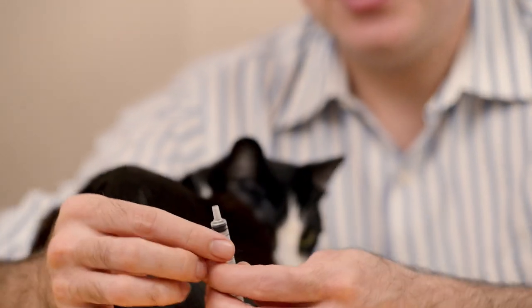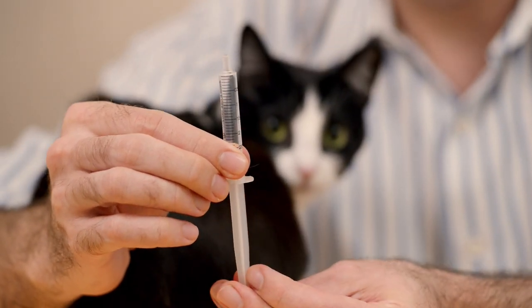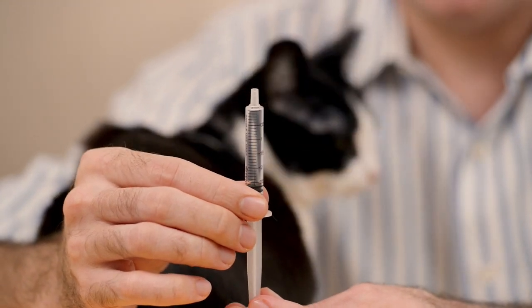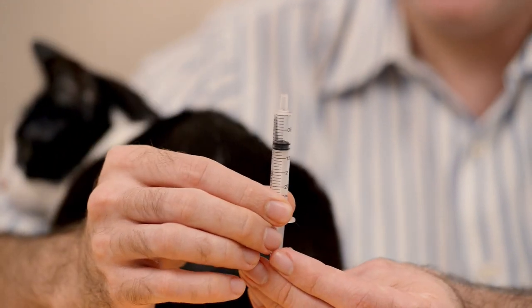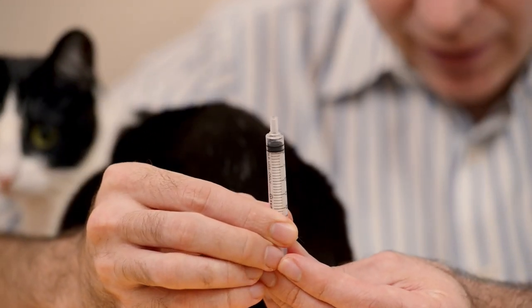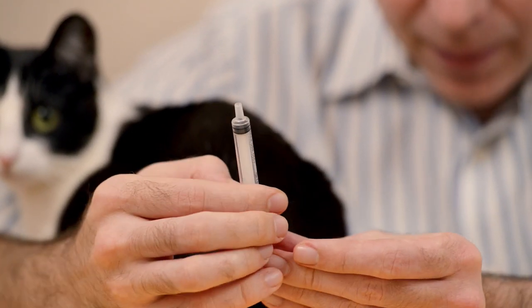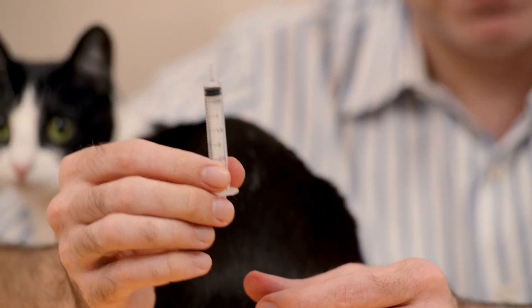A 3 cc syringe will have a total volume of 3 ml — so this is 3 ml. You'll probably never give this much to a cat, because the problem with larger volumes is you get a lot of spillage and your drug administration isn't as reliable. This is 1 ml, this is half a ml. Very small volumes like this are ones you should probably use a 1 cc syringe for.